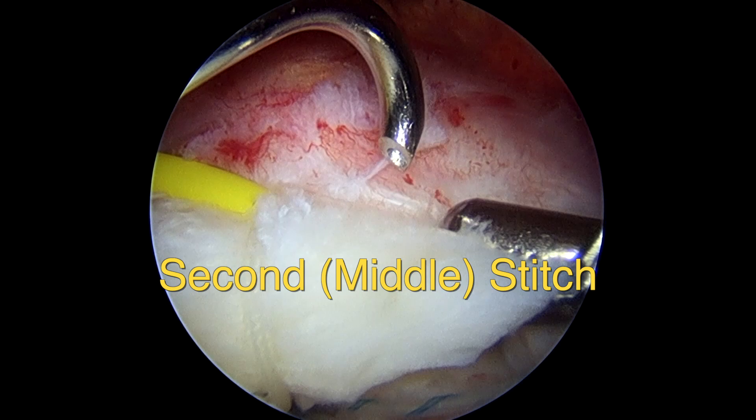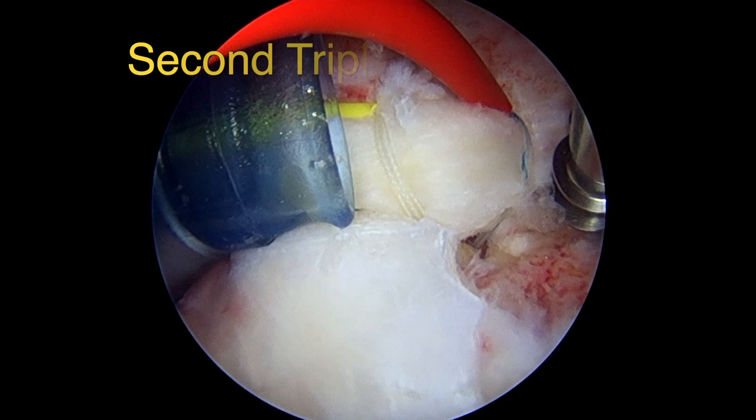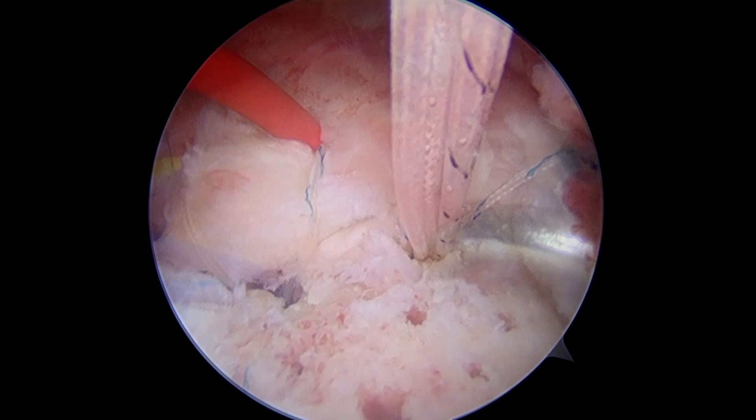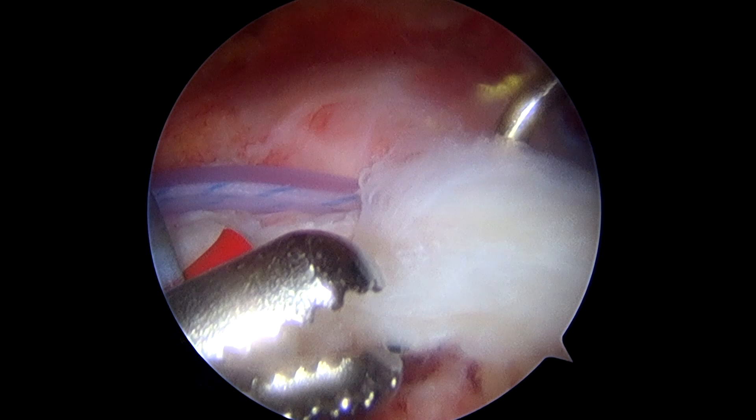Next, we'll put in the middle, or second suture, using a curved suture hook through a healthy bite of rotator cuff tissue, approximately a centimeter to a centimeter and a half medial from the edge of the cuff. After the third suture is passed and stored in a suture saver, we'll insert the second suture anchor and pass all three sutures using the appropriate curved suture hooks with shuttles, and store the sutures in suture savers.